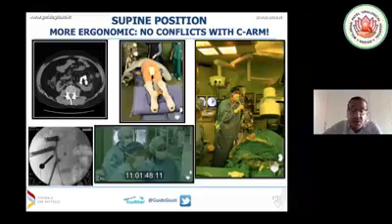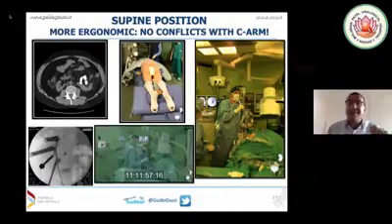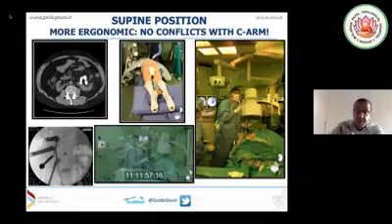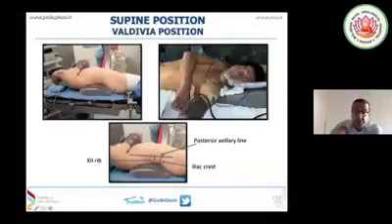By the way, this was one of the few cases, basically 3 out of 3,000 PCNL, in which I had to go back to prone position. It was a very difficult staghorn stone, and as you can see, due to this paraspinal orientation of this calyx, I had to go back to prone, meaning that if it is needed, I still go back to prone, but it has happened only 3 times out of 3,000 PCNL. These are my numbers. So now let's focus on the position.